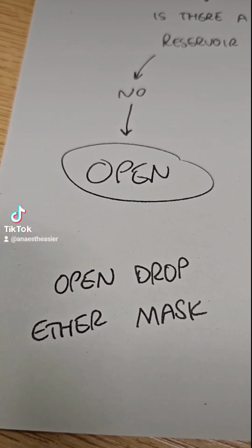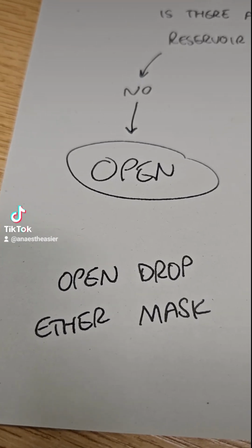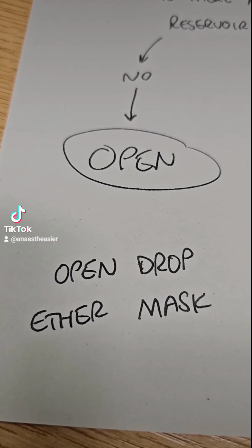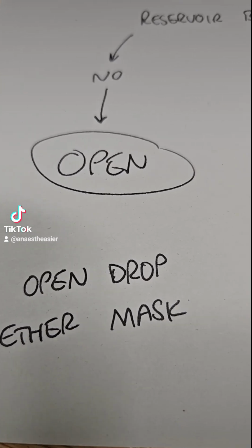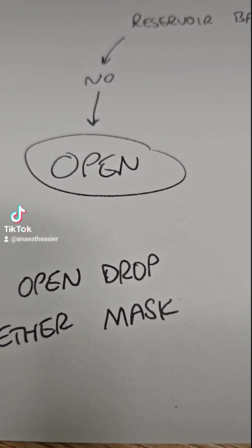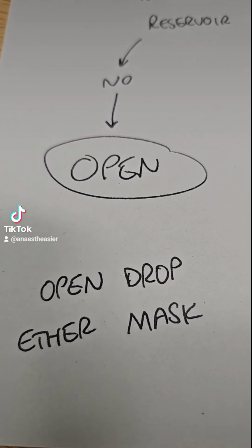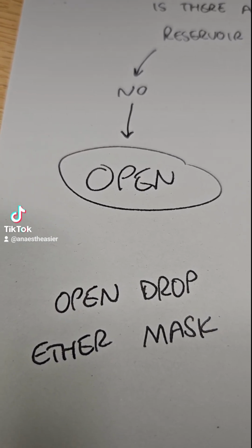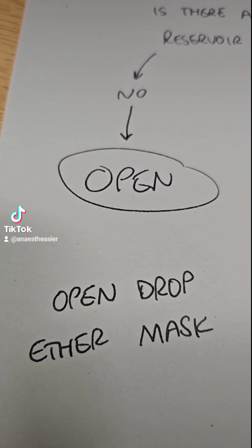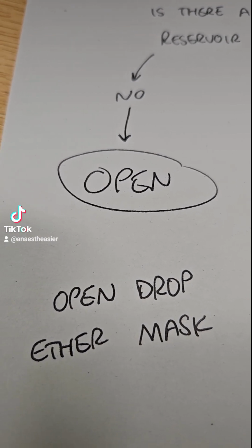The classic example, which they will expect you to know for the exam, is the open drop ether mask. There is no reservoir bag. The patient can breathe in and out, and they can take mixtures of any oxygen you're giving them and room air as well, and then the ether that you are dropping onto the gauze or whatever apparatus is on the mask, they will then inhale, but you have very little control over what they are breathing in and out.